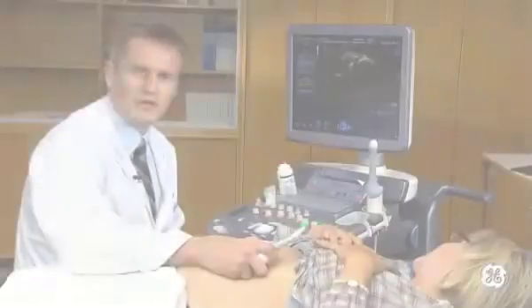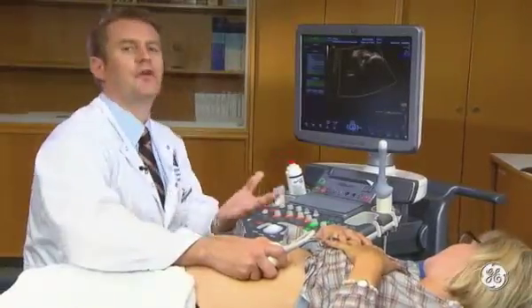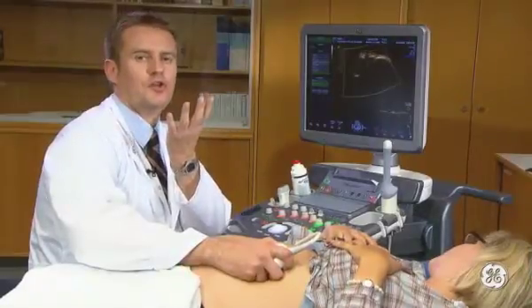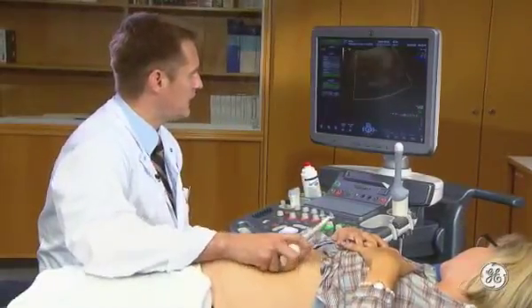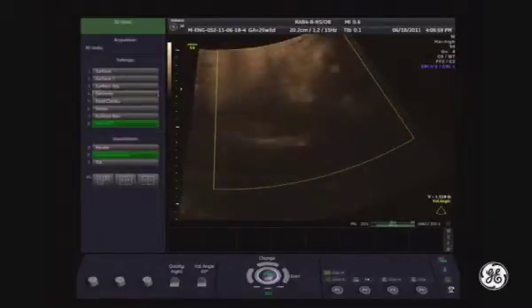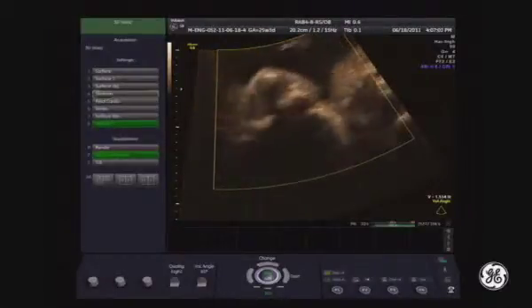Here it is of major importance to get the insonation from the mandibular, so from this side. So you need to create the relation between the transducer and the fetus like extension. So try to watch what I have on my screen, and I'm trying to get this relation now. It is really, really difficult here because I have a 26 weeks fetus.